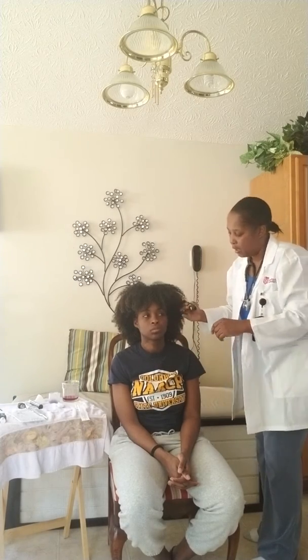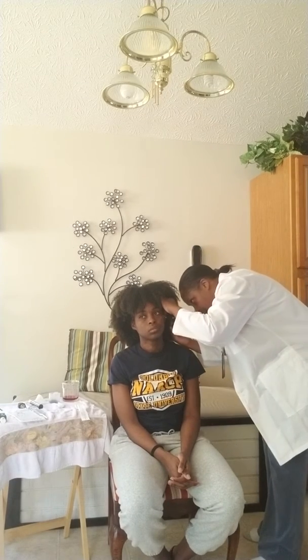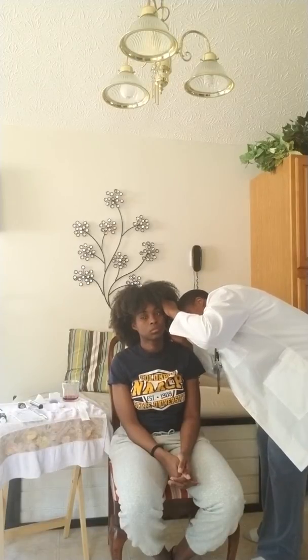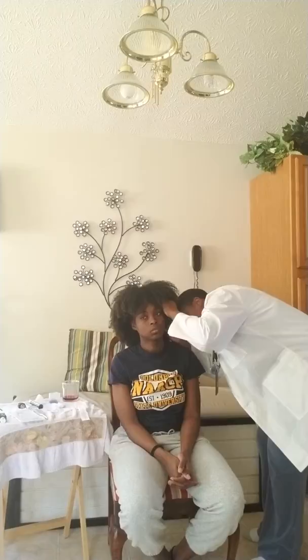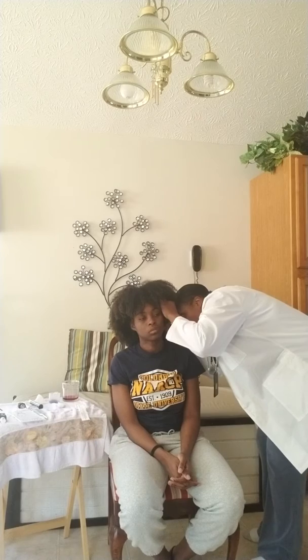And if you notice, I'm holding my otoscope like a pen, and you want to do this because it helps you protect the patient just in case they have to turn their head a certain way. And looking at her ear canal, also in this ear, the cone of light and the landmarks are all intact. Okay.